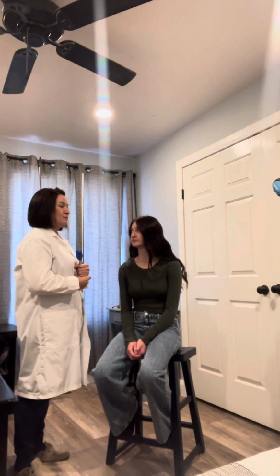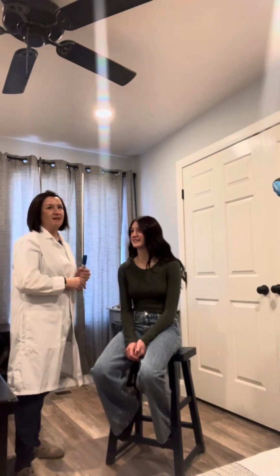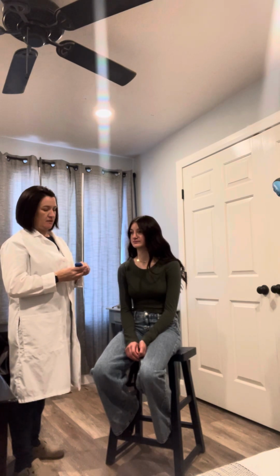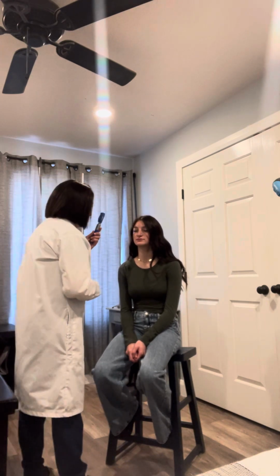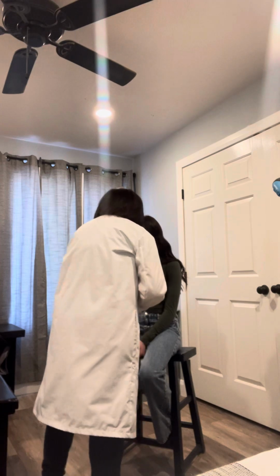I was supposed to do ears first. That's okay. We'll keep going with eyes. I'm also going to look for the red reflex and at the internal structures of her eyes. So good, red reflex. That's good.